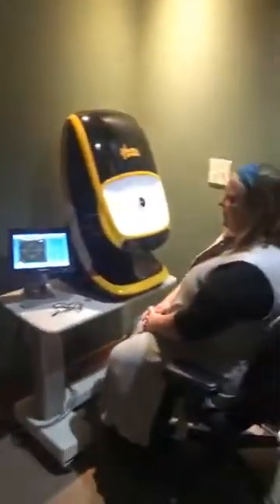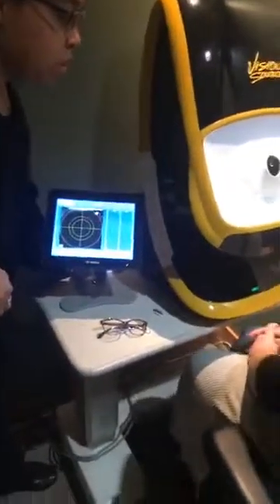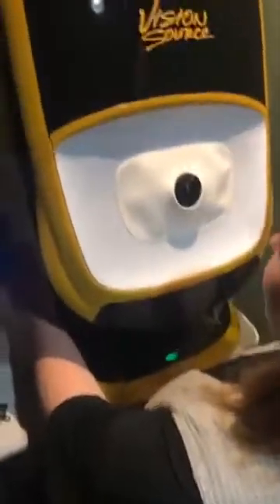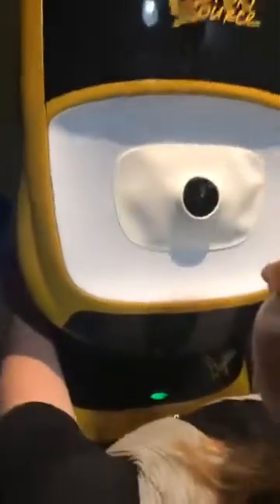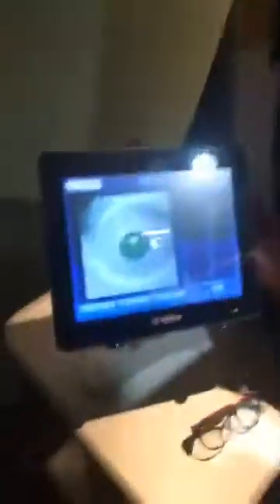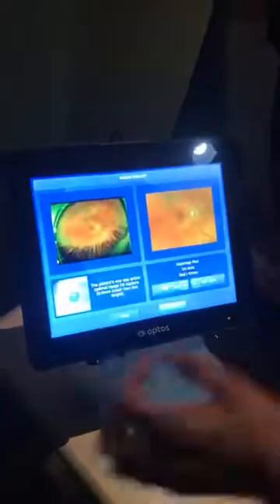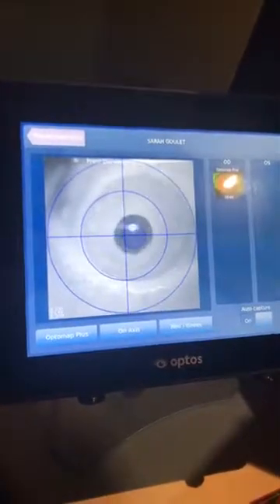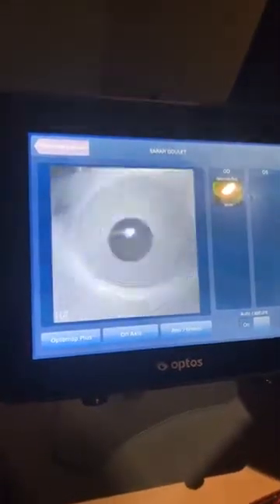So the way the machine works — we are going to be doing the pictures on Sarah today. When you come into our office, all you're going to do, if you decide to do the retinal screening, is take a look inside the machine. I'll be holding your head just a little so we can place you where I need you. So Sarah, I need you to look straight ahead to that blue light there inside. You're going to look inside the machine, look straight ahead to the blue light, slowly get closer to the blue light, and you're going to see a bright flash.